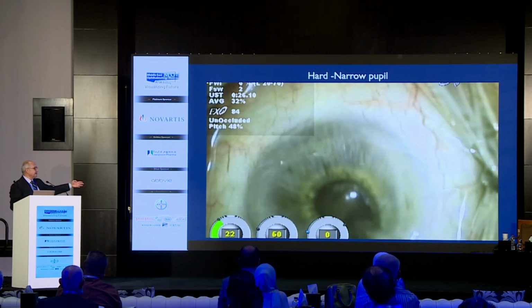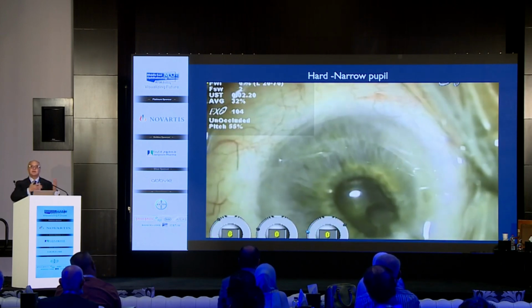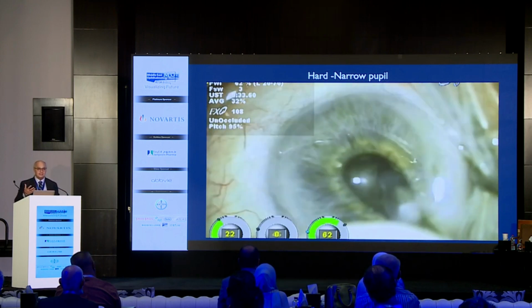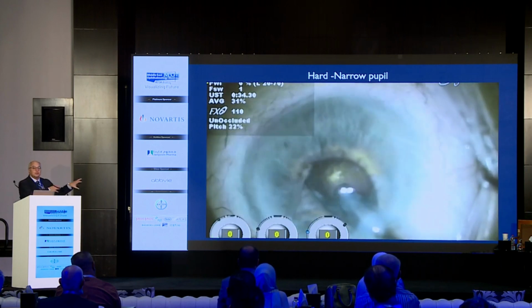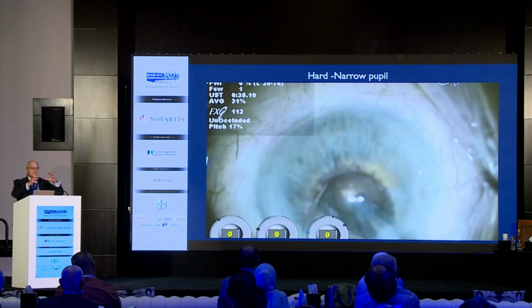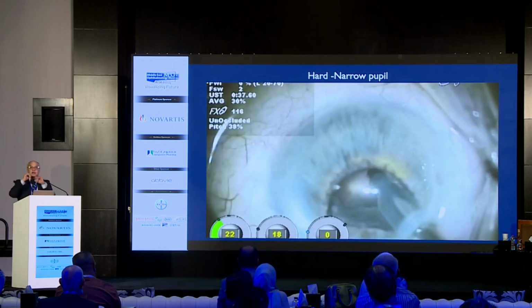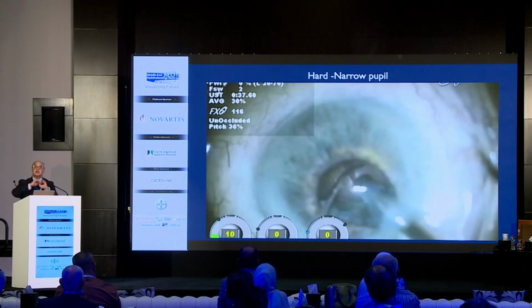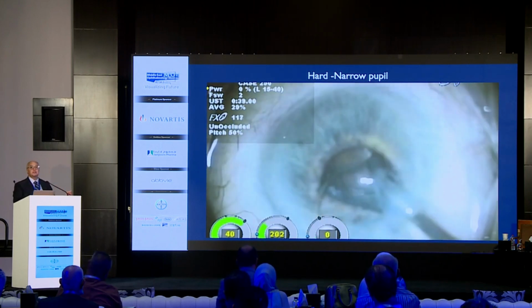Usually I don't use retractors for the pupil, but everybody will do whatever he likes to do. But again, I'm showing this case because the concept is that I can shave what I see and then create the crater, so I can go very deep and get the result exactly what I want, saving the cornea and saving the posterior capsule.